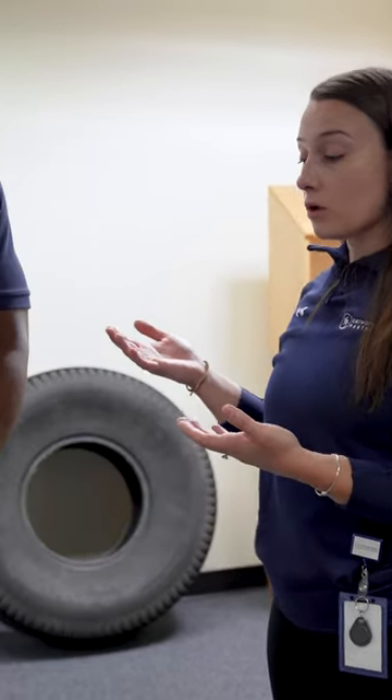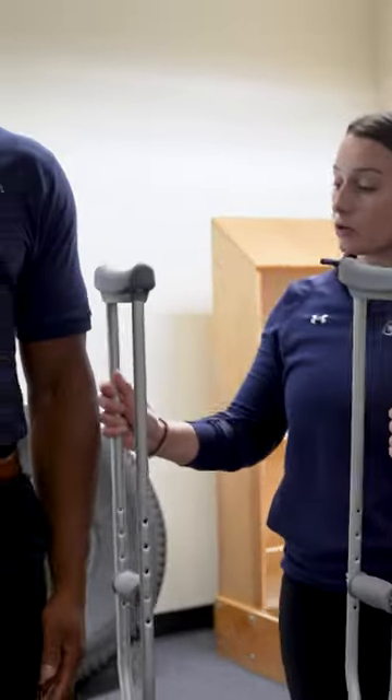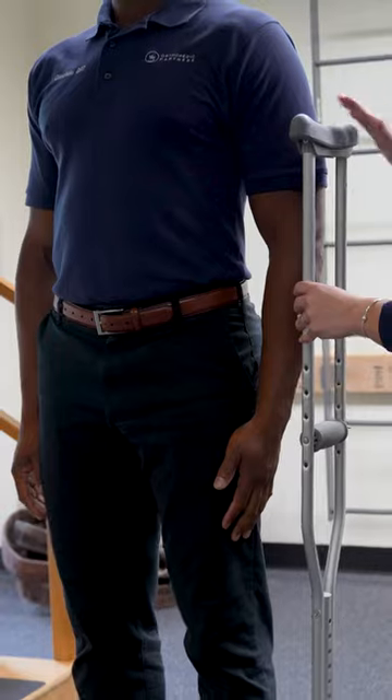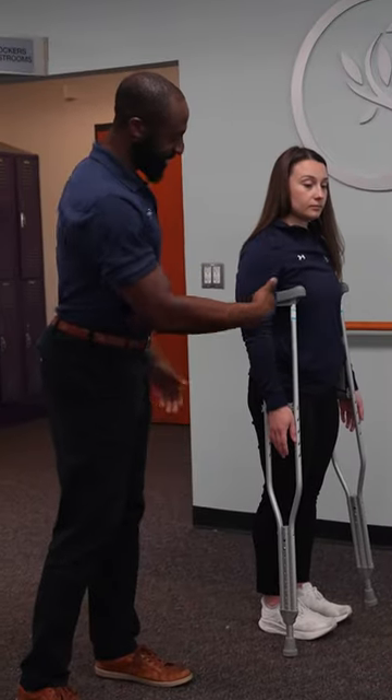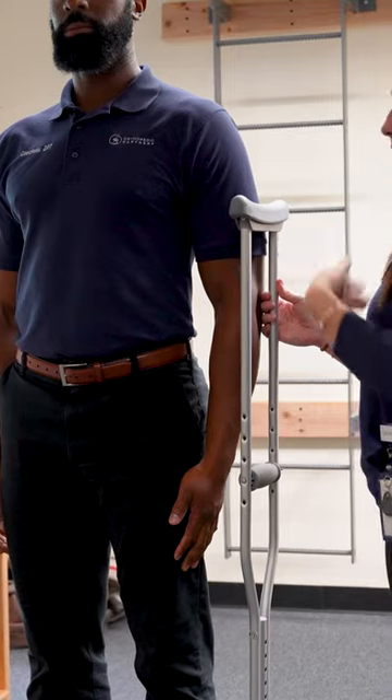You want to make sure that you're standing nice and tall with the crutches next to you. Ideally you want to have the crutch on the outside of your arm here resting. Where you want the crutch handle to fall is about two inches, or about three fingers distance, between the head of the crutch and your armpit area.